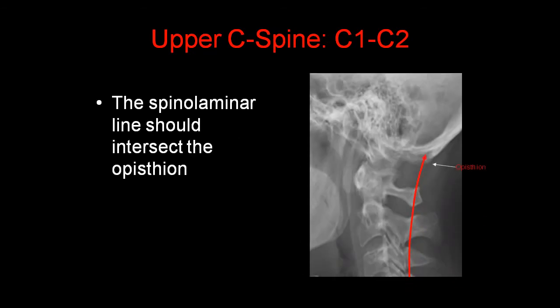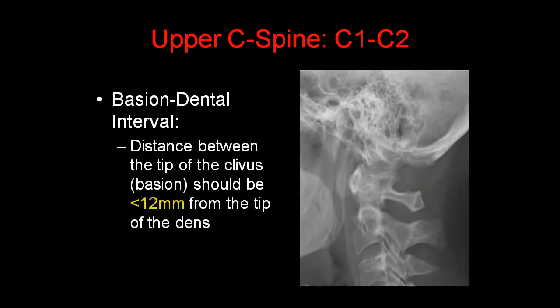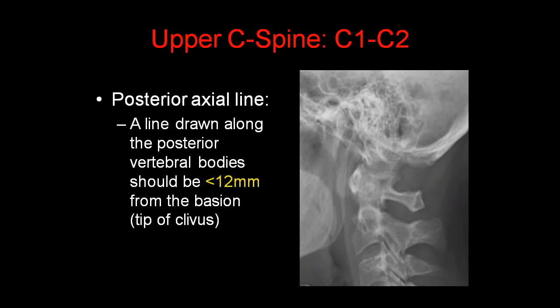In addition, the spinal laminar line should always intersect the opisthion, which is the bony protuberance at the base of the occipital bone. Also look at the basion-dental interval — the distance between the tip of the clivus (the basion) and the tip of the dens — which should be less than 12 mm. Also look at the posterior axial line, drawn along the posterior vertebral bodies, which should also be less than 12 mm from the tip of the basion.